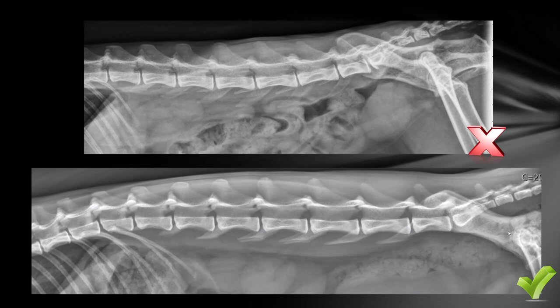But if you're really interested in optimized evaluation of the spine and the intervertebral disc spaces, you want a radiograph like this, where the iliac wings are beautifully superimposed, transverse processes are superimposed with the other side, and you see also the rib heads are perfectly at the same level.